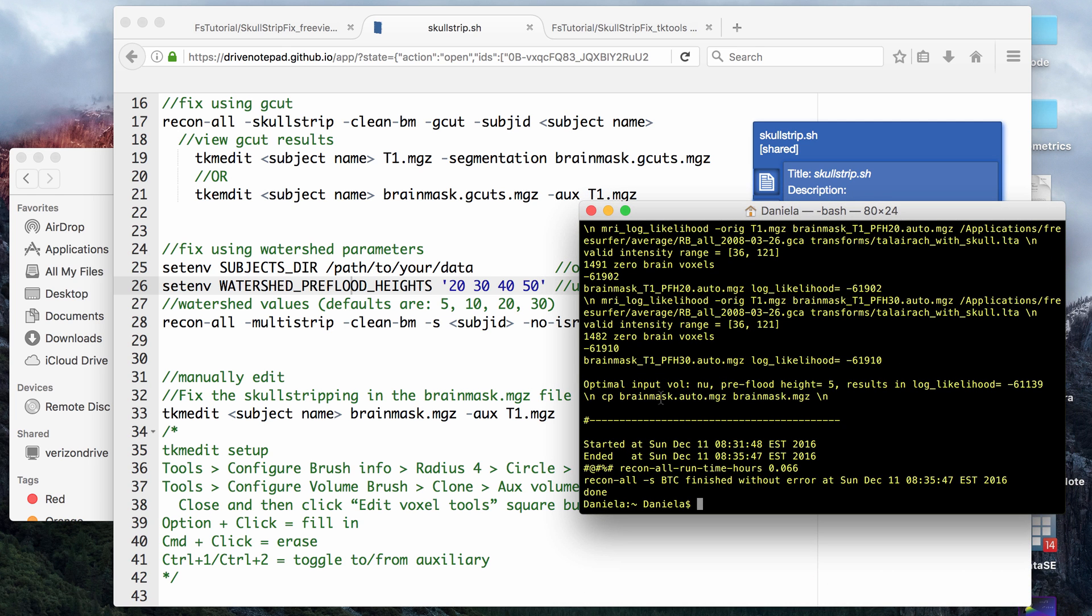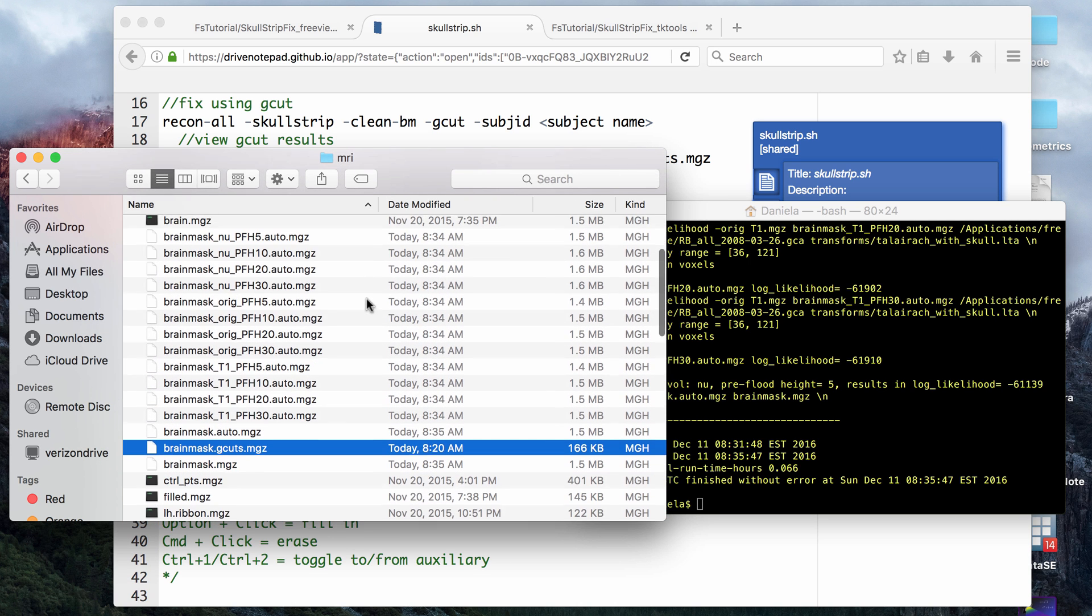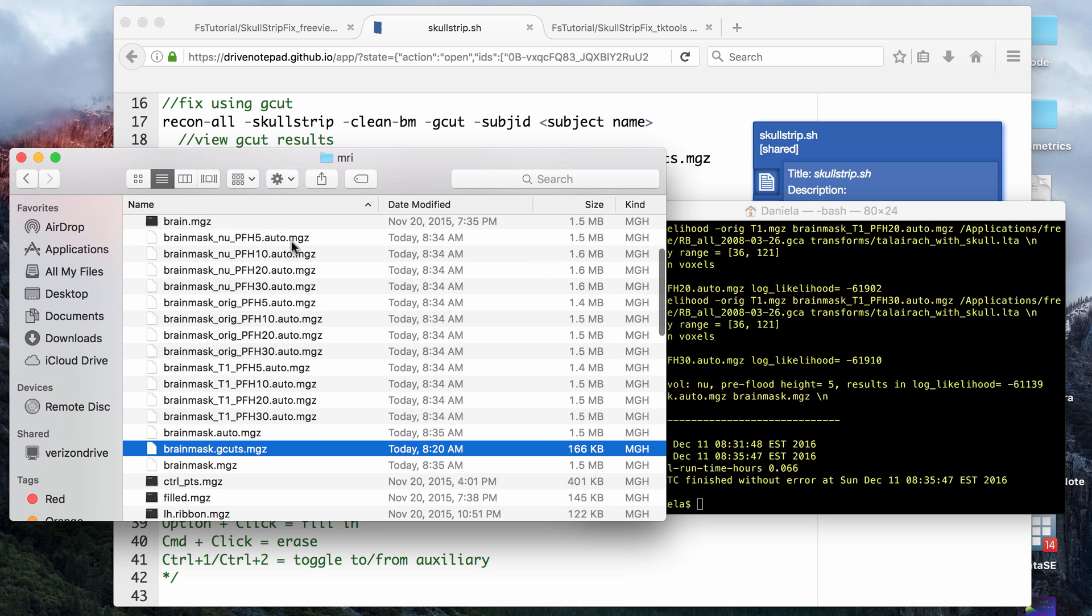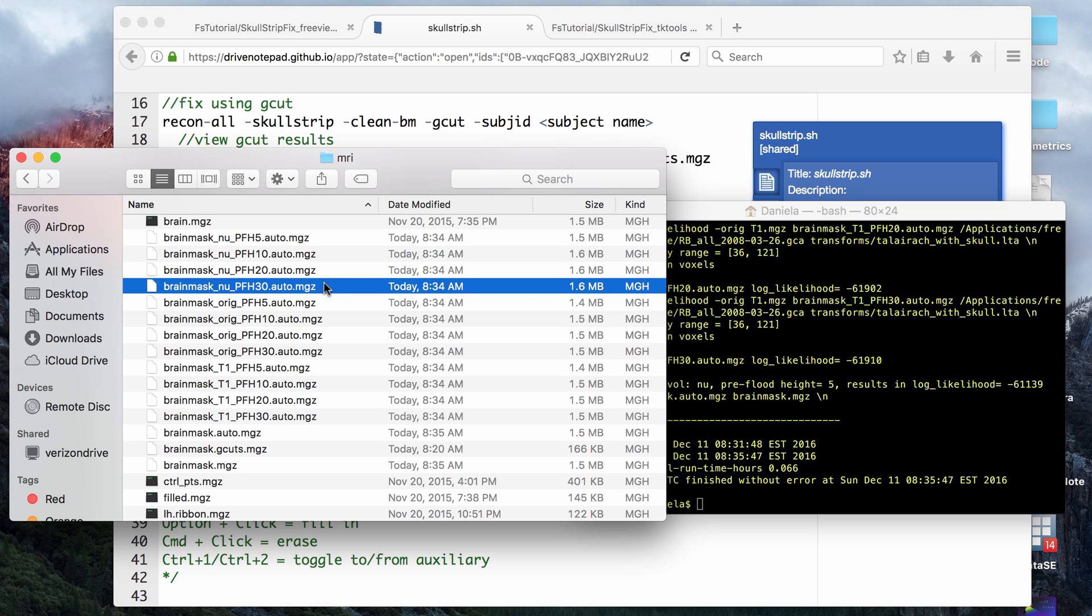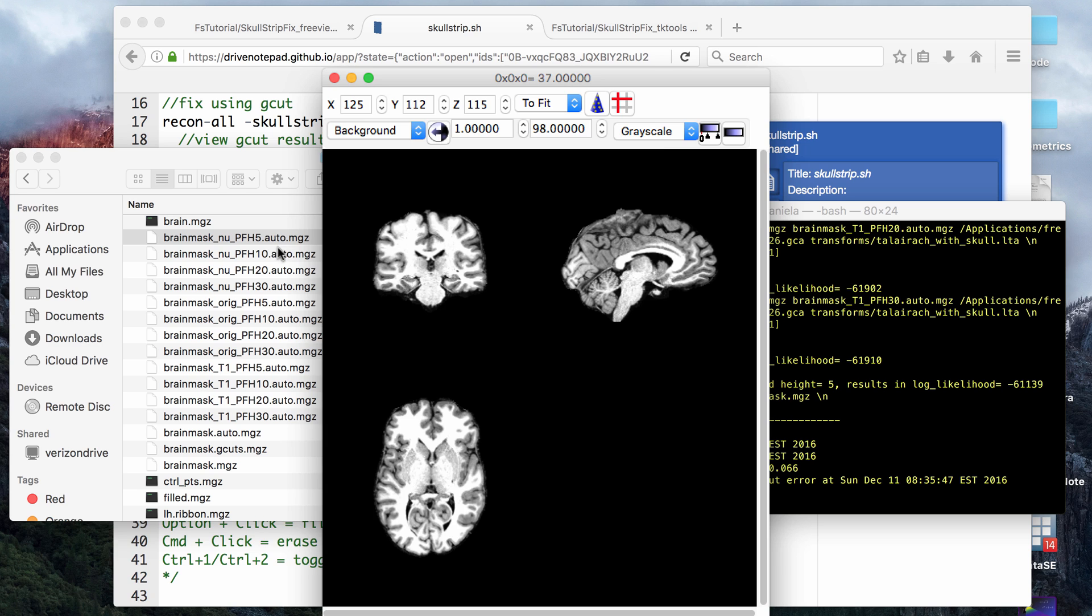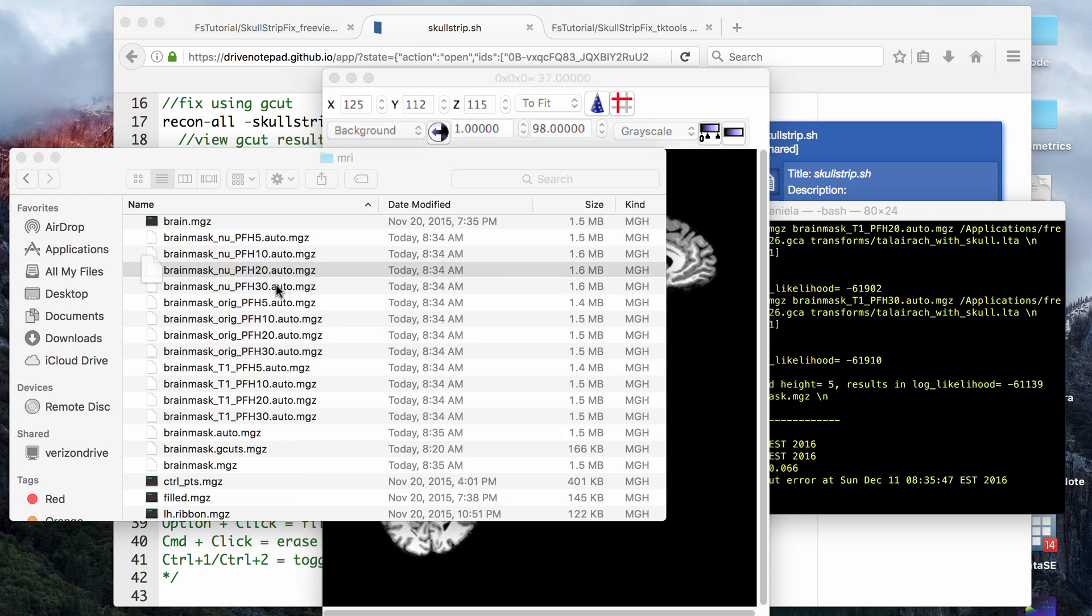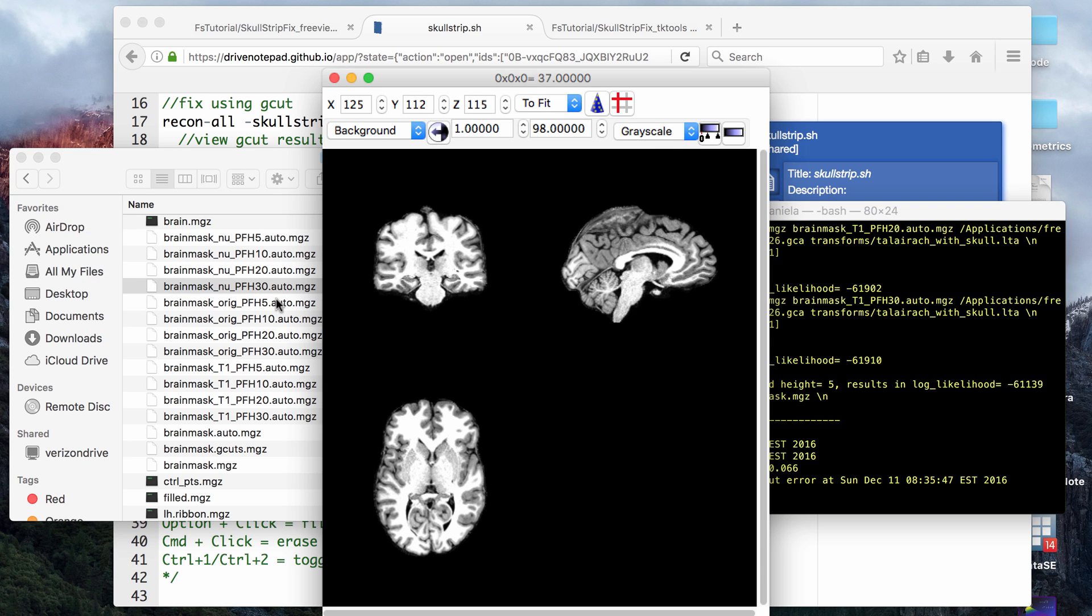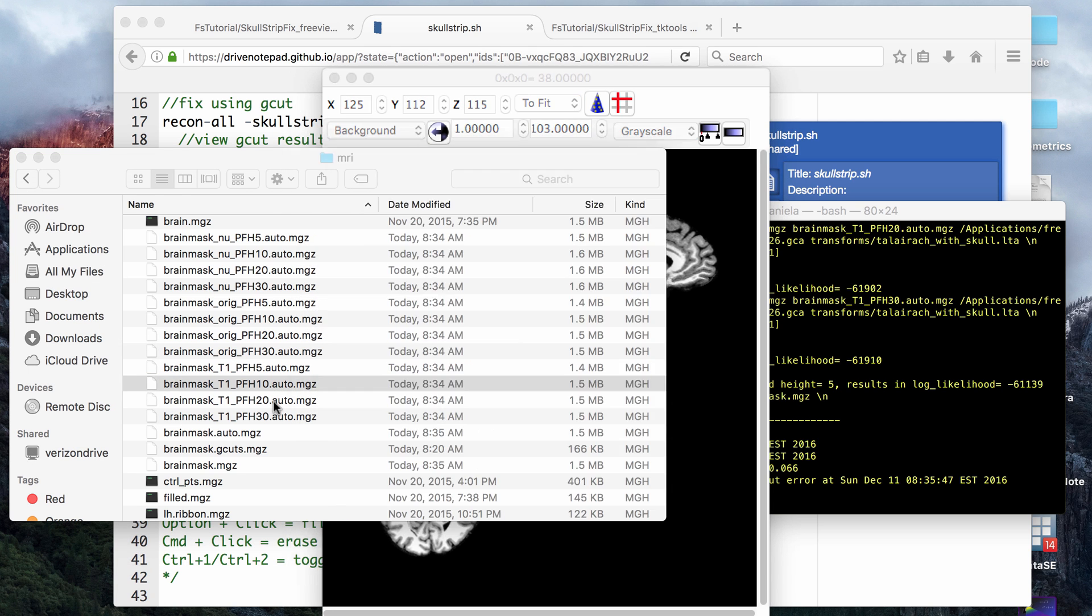Okay, so that finished running, and it took about four minutes, and now if you look at the MRI folder, there are 5, 10, 20, and 30 brain mask files for the brain mask new, the T1, and the original brain mask. You can now look at the different outputs, and this one does not look like it was very good for example, and you can see what the different thresholds do to the brain mask. You can pick from those which one you want, and you can also use that as a way to determine what type of thresholding you want to do for your data.